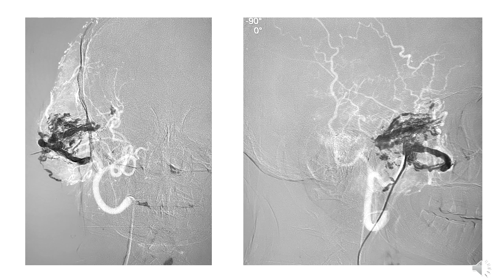We can see on this that there is a very nice progression of the glue injection in a lot of vessels. Most of these I can tell are veins, they are not arteries, and these tiny ones next to the larger channels may be some of the arteries which are shunting into the tumoral veins.